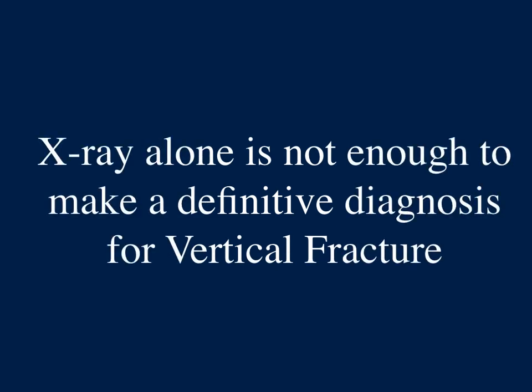But what about vertical root fracture? For vertical root fracture here, X-ray alone is not enough to make a definitive diagnosis.